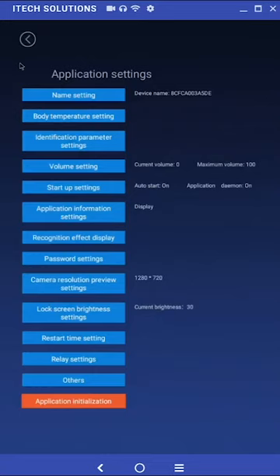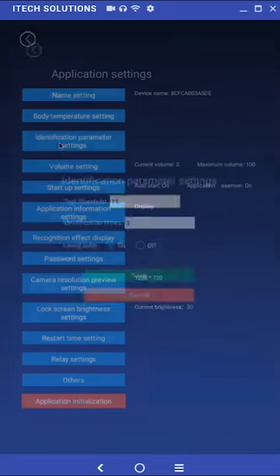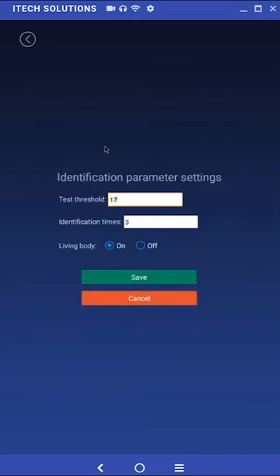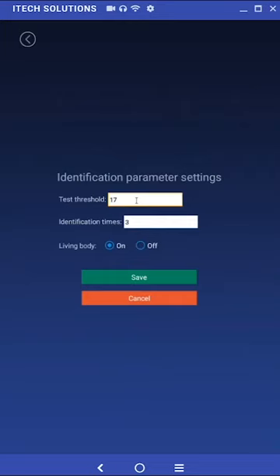Identification parameter settings. The options listed will be the test threshold, identification times, and living body. The test threshold is used when checking pictures into the face database. The higher the value, the lower the picture requirements are needed. The identification times determine the number of attempts to identify whether the person is a registered user.